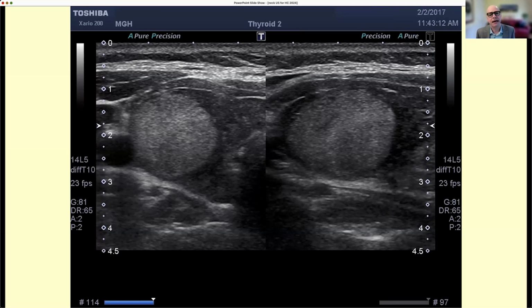It is also in the context of a thyroid autoimmune disease here. I think the thyroid is hypoechoic, so it could be one of those nodules that we see in that context. But this is very well circumscribed, very solid. This is a solid nodule that is isoechoic.